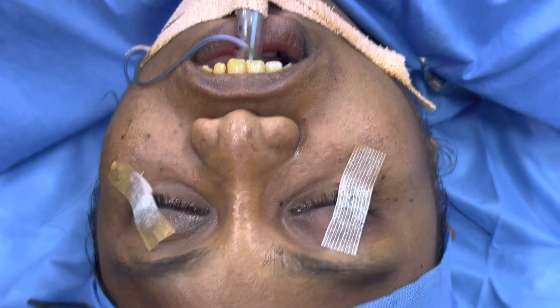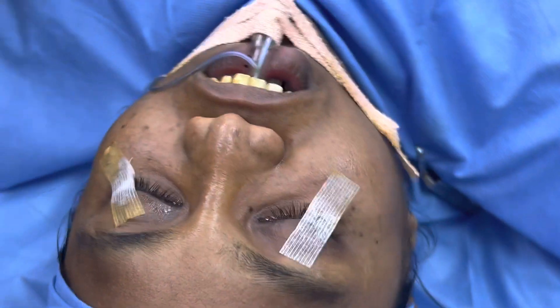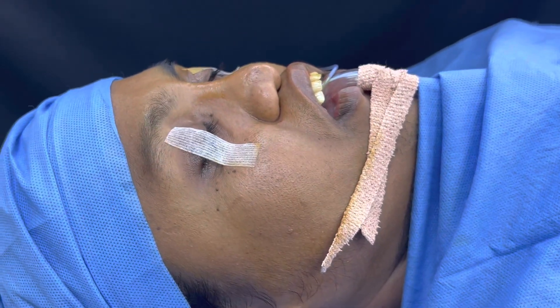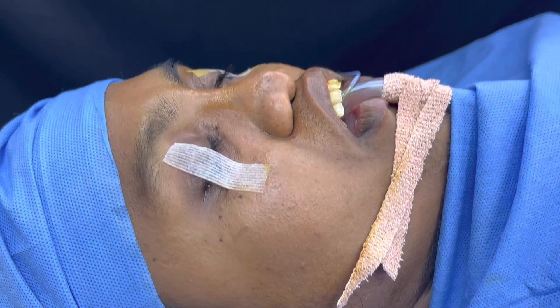I'm going to be working on the cheek, the piriform rim — or the base of the nose — and the upper jaw, along with the soft tissue of the lips and the underlying structures.